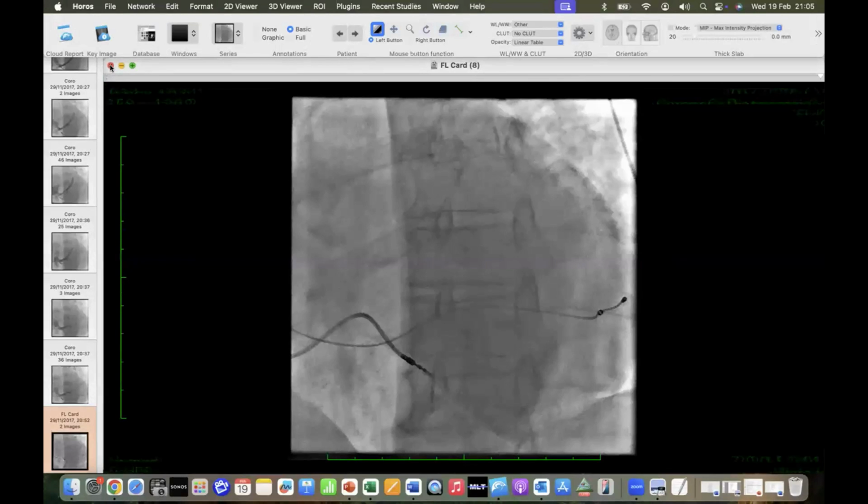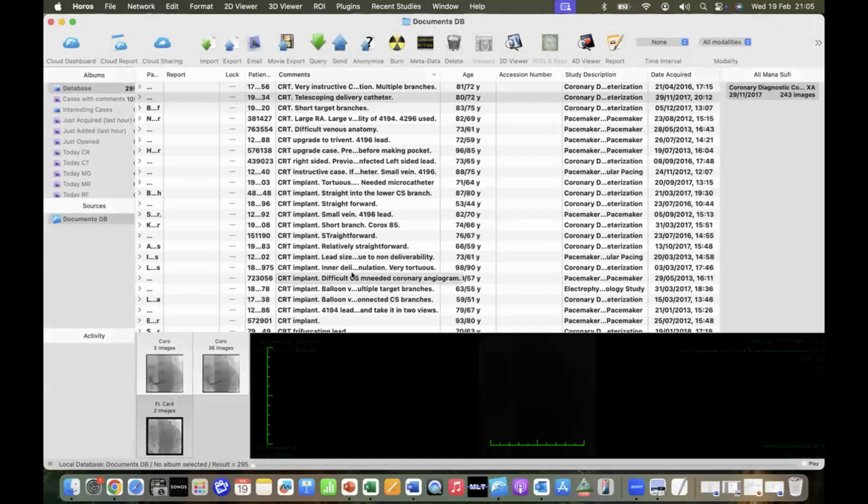Sorry about that. And any comments, Hasham? No, I think you got away because there was some challenging anatomy ahead. You had a valve and you found a lateral branch, and so this was a good way to just get your subselect in and park it in a nice place.